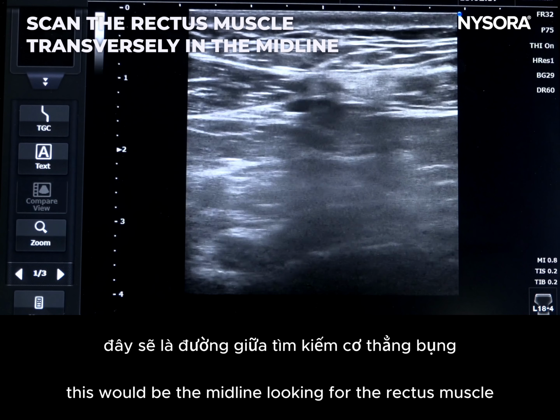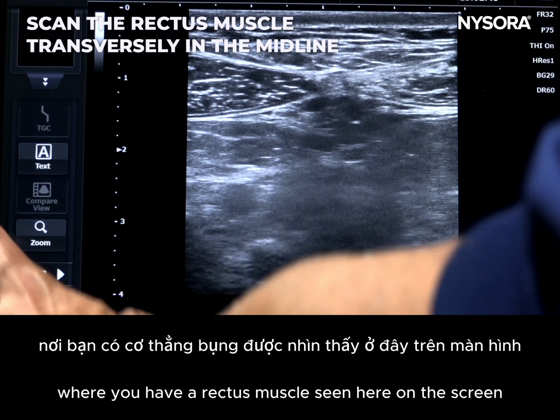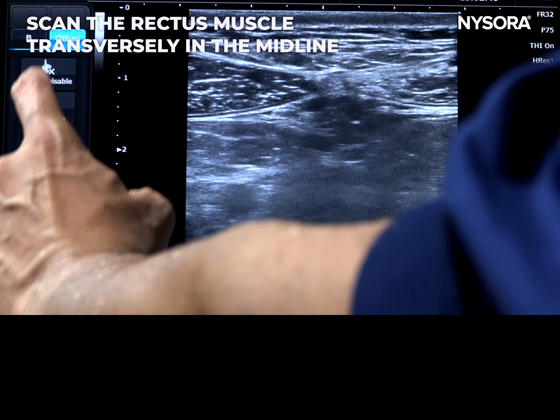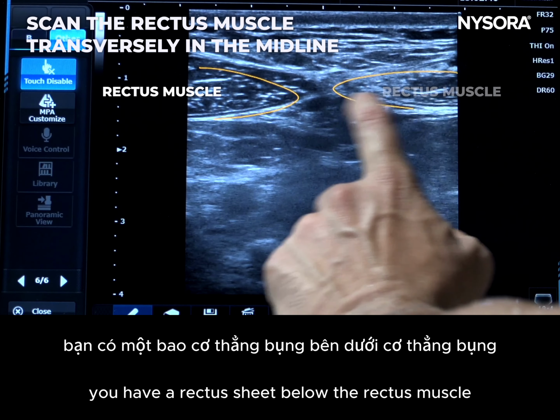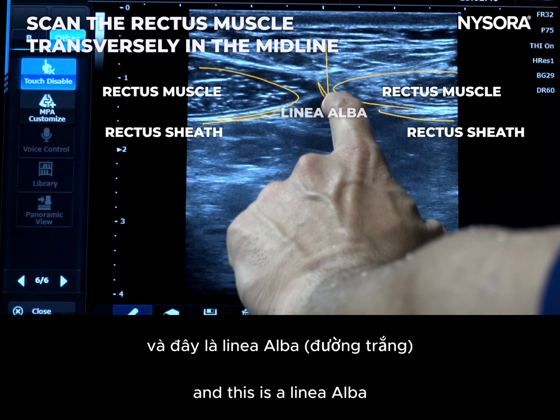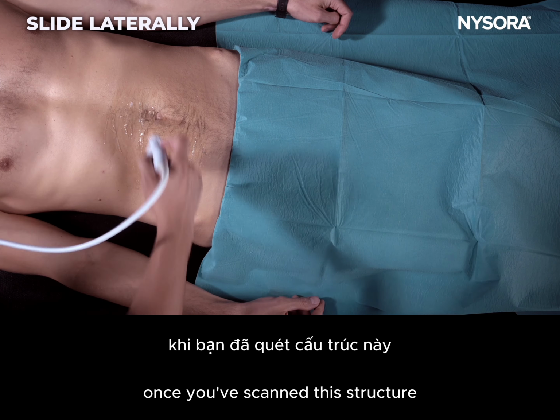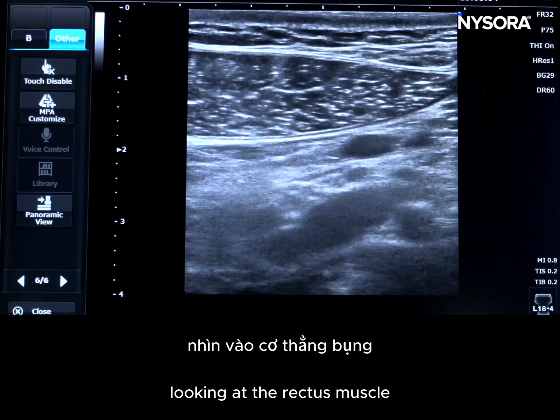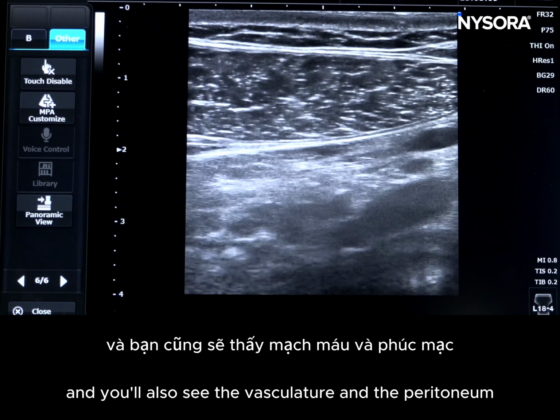the rectus muscle. I call this the bow tie sign, where you have a rectus muscle seen here on the screen, and it looks like a bow tie. You have a rectus sheath below the rectus muscle, and this is the linea alba. This is your starting point of scanning. Once you've scanned this structure, you will move your ultrasound probe laterally, looking at the rectus muscle, and you also see the vasculature and the peritoneum.